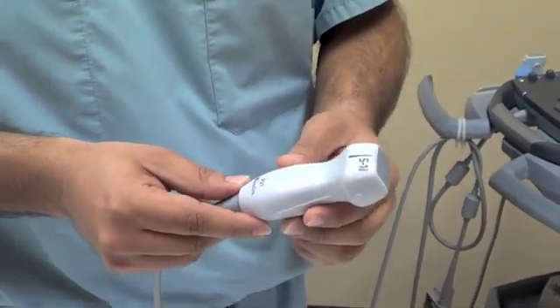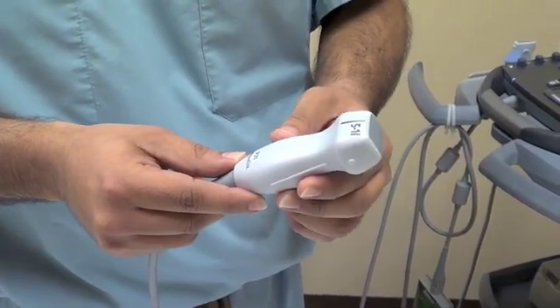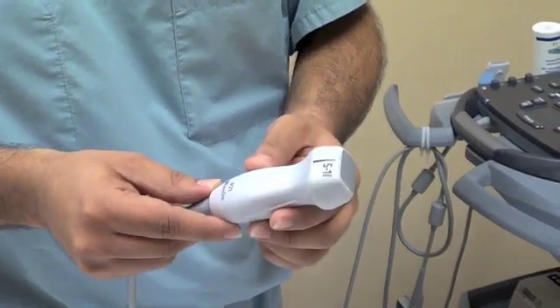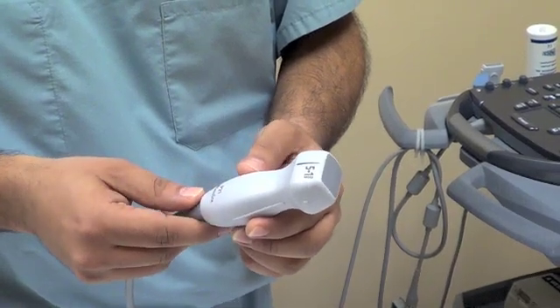One other advantage of this probe versus the flat probe is it has a higher frame rate. So when you're looking at things on the ultrasound image that move, such as valves or cardiac activity, it shows up better generally on this cardiac probe rather than the vascular probe.